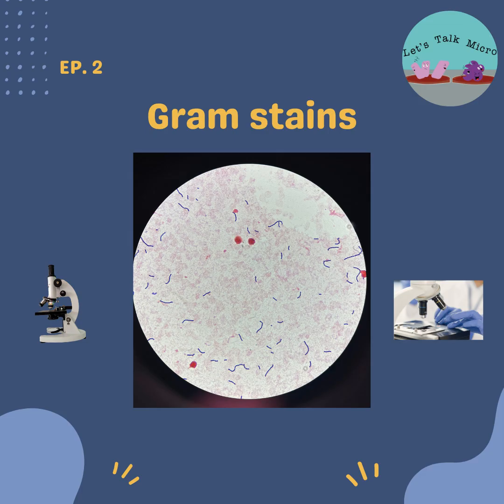Well, it varies on the sample type, right? Like I mentioned before, you have a cut, they swab the area. Let's say you have painful urination, they collect the sample like that. They do blood cultures. So it all depends on the source type. So you have the swabs. There are different types out there. Some might have a liquid, which is called Amies media, which preserves the organisms.